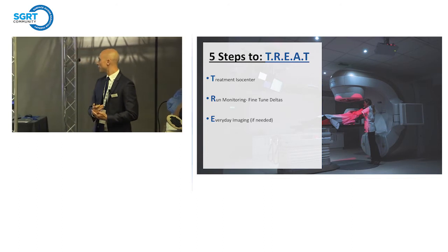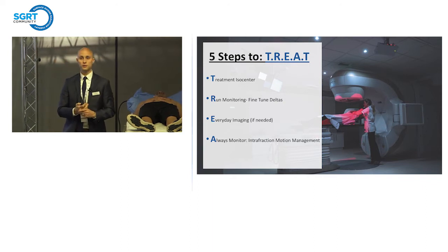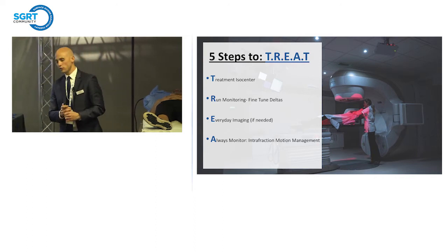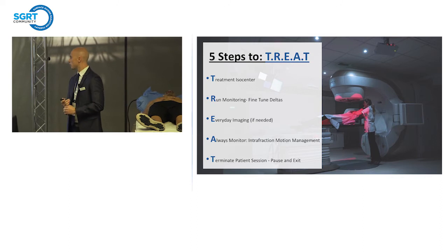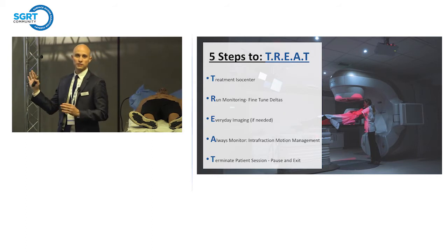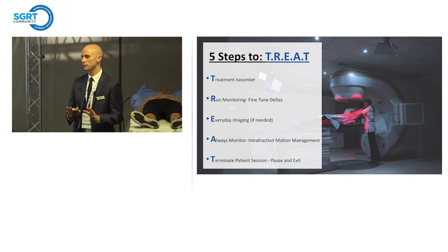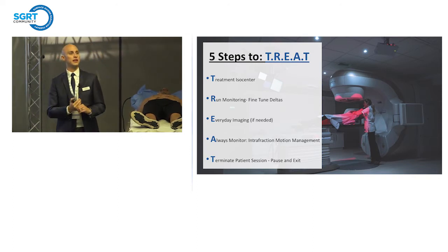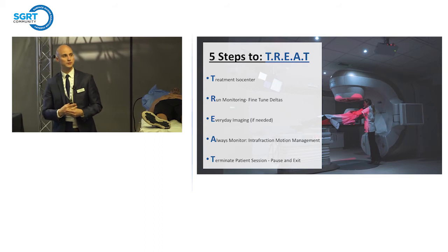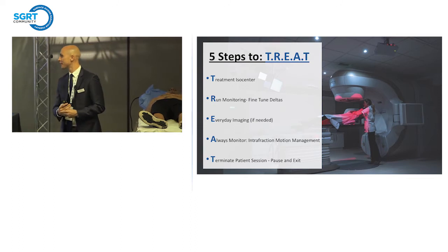After that, the letter A stands for always monitoring our patients. We're going to continue to monitor our patient for intrafraction motion management throughout the entire patient treatment. After we have delivered our entire prescribed dose, we are going to terminate the patient session, and then we will pause and exit. So these 5 simple steps are the same steps for every workflow, whether it be an extremity, an SBRT, SRS, abdomen, whatever it is you're treating, same steps for each one of those sites. We are going to try and refer back to these 5 steps as we go along. So take a mental note right now of what all of those mean, because we will try and bring it up in the future.